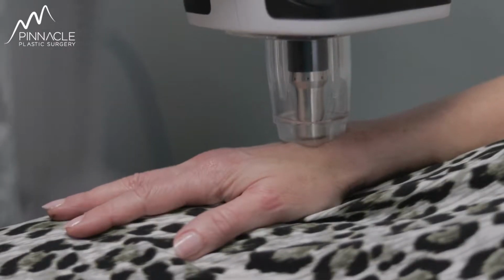The other great thing is that there is no wound, so there's no area that has to heal, that you have to treat with a Band-Aid and ointment, and there's going to be no scar. So patients love that. It also gives us a way to track that lesion over time. So once we have an image of that lesion, let's say it changes 2 years down the road, we can confocal it again and compare it to the images from a couple years ago.